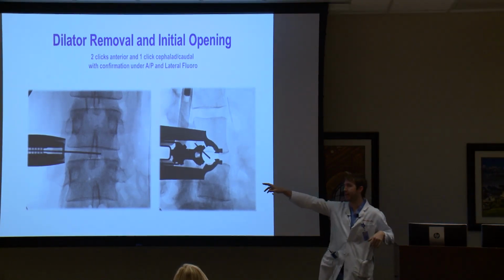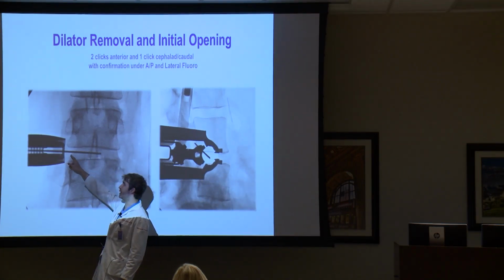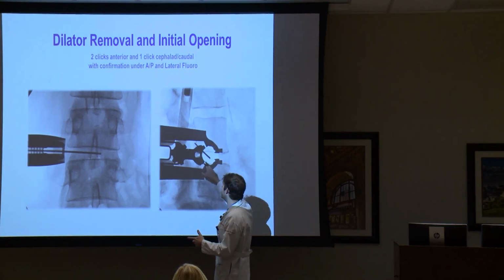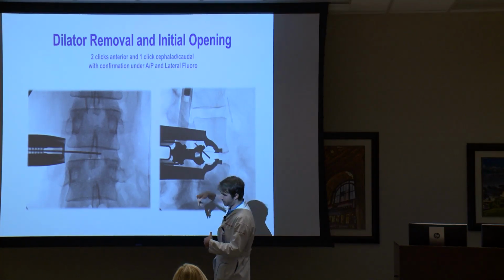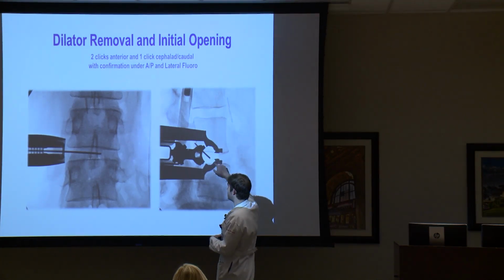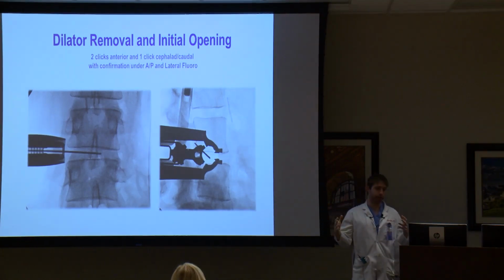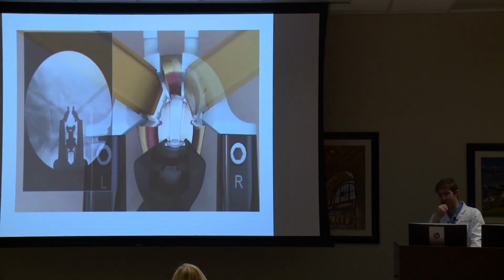As you can see, the retractor is in there, and you've got that pin through the disc space, so you're safe and you're in a good spot, and you can move the retractor around. This is what I'm looking at, straight down when the patient's on their side: the disc space, that pin, and the retractor starting to open up to show me what I need. This is essentially what I see when I can look down there.